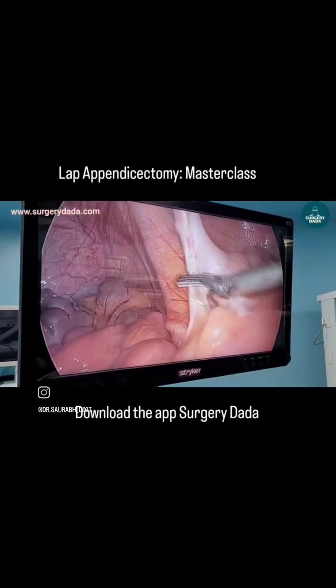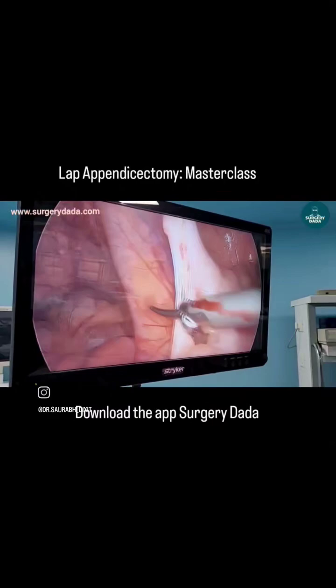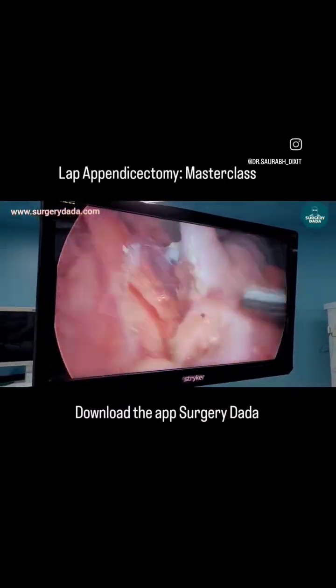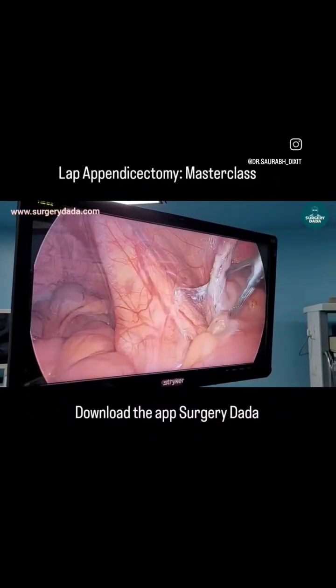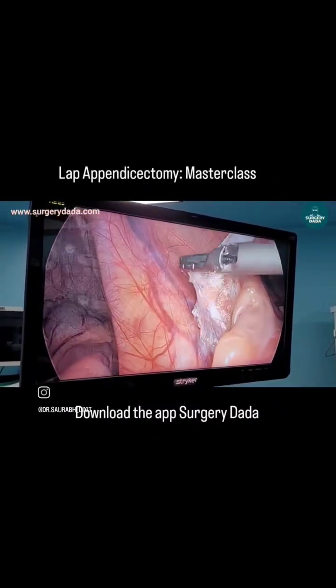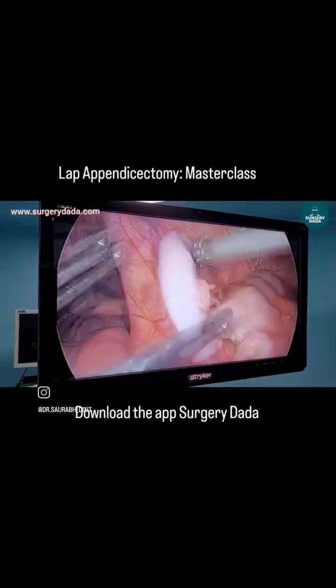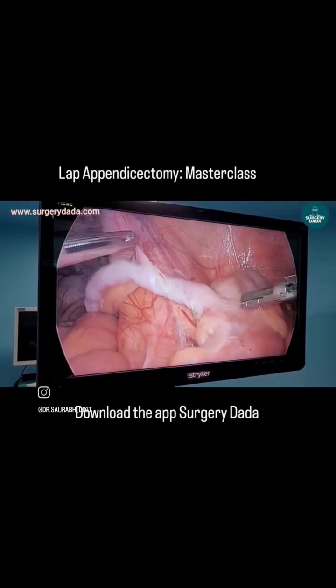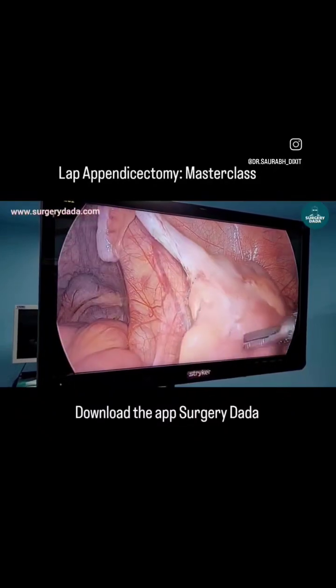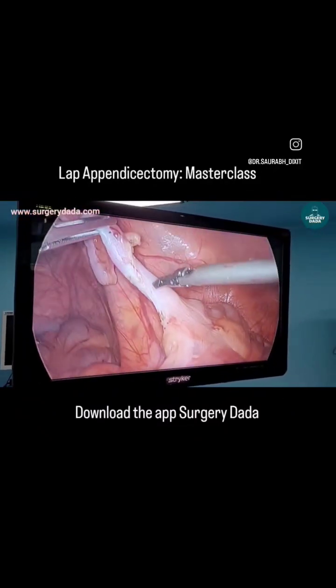You can see I'm working around the fold of Treves, detaching the attachments. Peri-appendiceal inflammation is really minimal because this was an early presentation. You can see the white flimsy fibers are all set. Now you can appreciate the critical view of safety: the appendix is at 10 o'clock, the cecum is at 3 o'clock, and the ileocecal junction with the terminal ileum is at 6 o'clock.